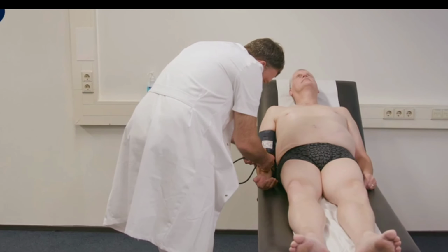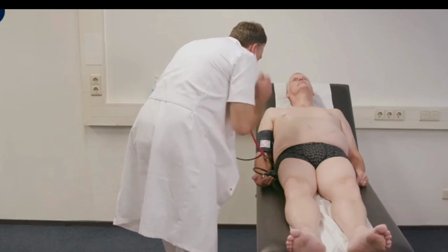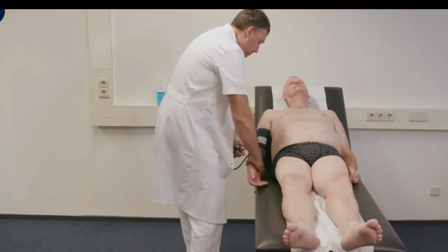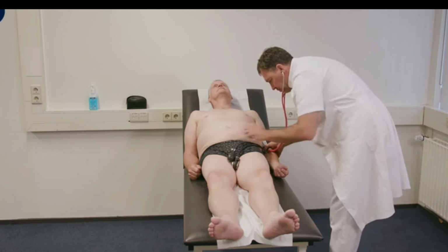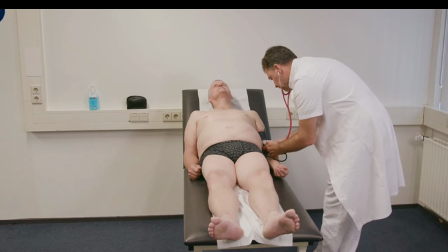If the blood pressure reading is outside the normal range, it is good practice to repeat the blood pressure measurement and also consider assessing the blood pressure at the opposite arm. Note that measurement of blood pressure in the clinic setting is substantially inferior to home or ambulatory blood pressure monitoring.